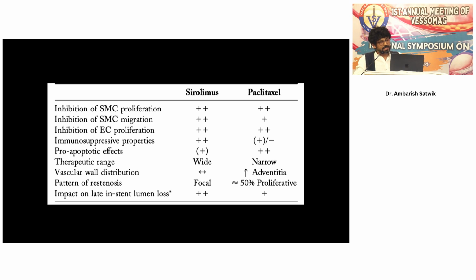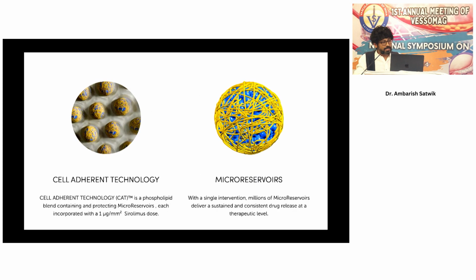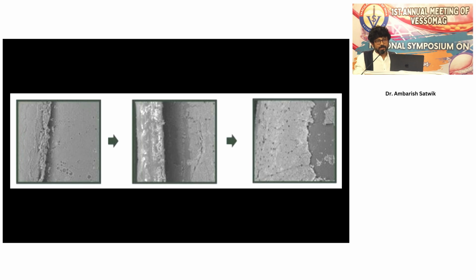As has been established, it inhibits the smooth muscle cells most vigorously. Some of the newer balloons that have been made have sirolimus with this kind of technology. It's like sirolimus being on a sticker. So because it's on a sticker on the balloon, I mean not a sticker, but on a nano level on a sticker, when it's conveyed to the location, which is distal, the below the knee segment, it doesn't get washed off the balloon. And when it is inflated, it's like a sticker on the other side, so it goes and sticks to the artery and moves within the vessel. It's a phenomenal nano encapsulation delivery, so the crystallization doesn't happen, and therefore microembolization and slow flow is not seen.